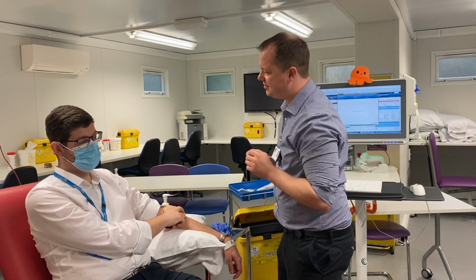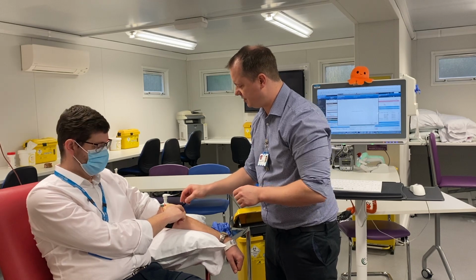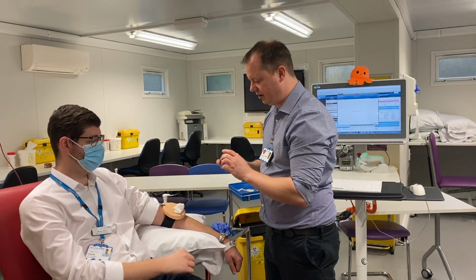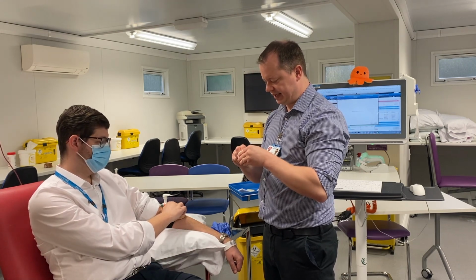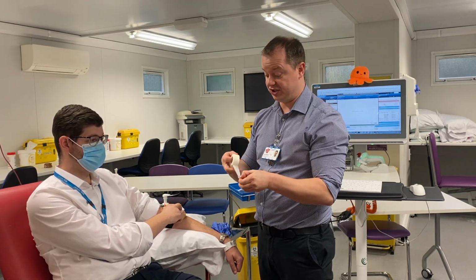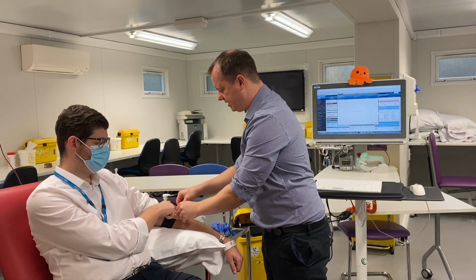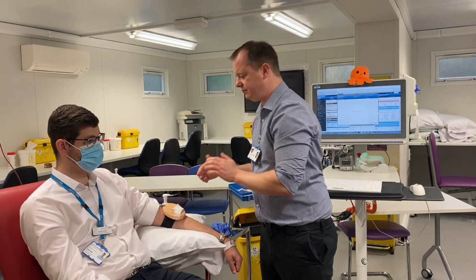I can then say to my patient, are you okay? Can I have a look at this, please? I can make sure that it's stopped bleeding, and I can say, just put your finger on that for me. I can then get my tape, find the end, which is quite a challenge sometimes. Put tape over this so it stays in place. And then we're all done.